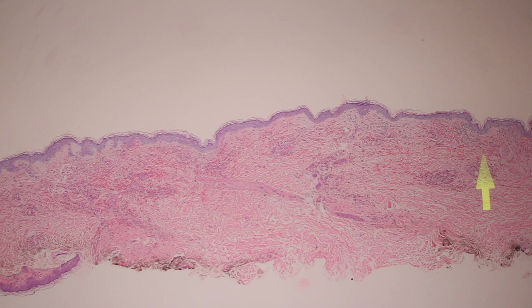Now, most types of regular LCV that we see often are going to have a C3, complement 3 deposition in the vessel walls, and also a lot of fibrin or fibrinogen surrounding the vessels. That's the typical pattern you see for most types of LCV. Now, there are a lot of other subtleties for different types of vasculitis, particularly the systemic ones, that we won't get into today. But when you're looking for Henoch-Schonlein, what you'll see instead, you'll see the fibrin and fibrinogen, but around the vessels in the vessel wall, you'll see subtle deposits of IgA. And I find that in my experience, most of the times when I see it, it's quite subtle, and you have to look really closely on high power around the vessels if there's any suspicion for Henoch-Schonlein to make sure you don't miss it.